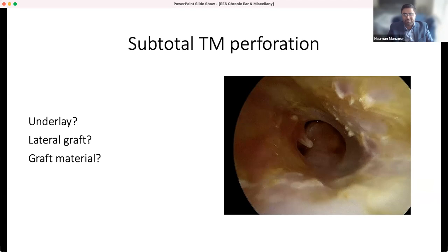So I think you just have to be careful, because you can easily blunt that anterior angle if you are trying to reflect a graft there. If you do that, you have to make sure that you really pack the ear after you flip everything back down. You have to pack that area in such a way that you still maintain that anterior acute angle.